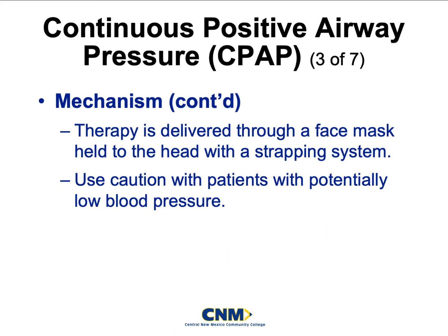Okay, so this mechanism, still we are delivering this through a face mask that's held to the face through a strap system. It's basically a strap system that covers the top of the head and comes around the bottom side of the neck. And the actual straps attach right directly to the mask.